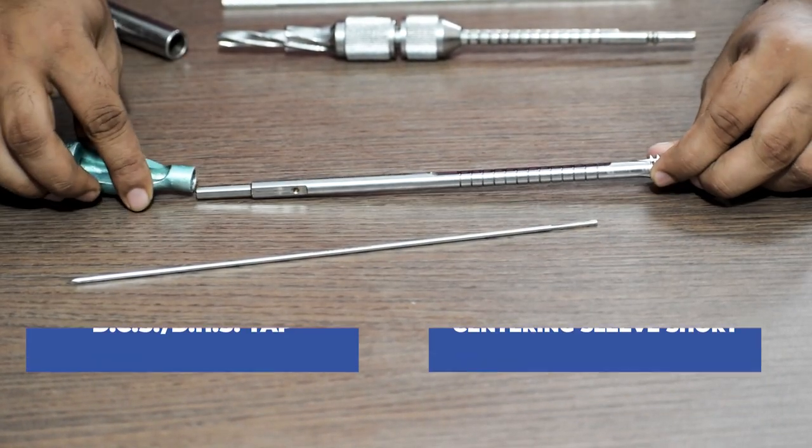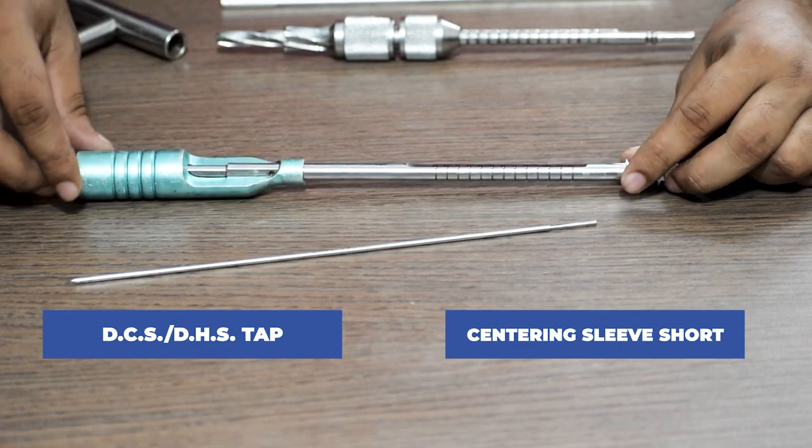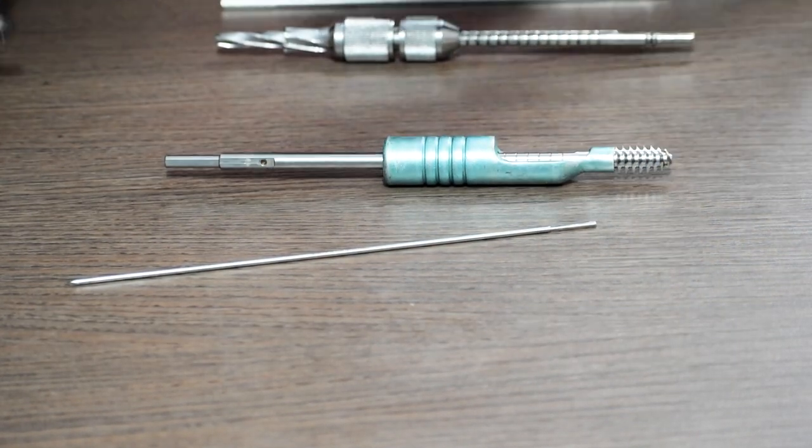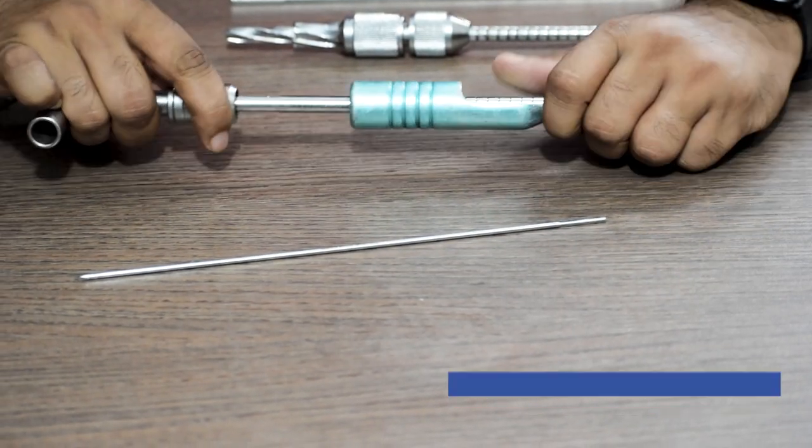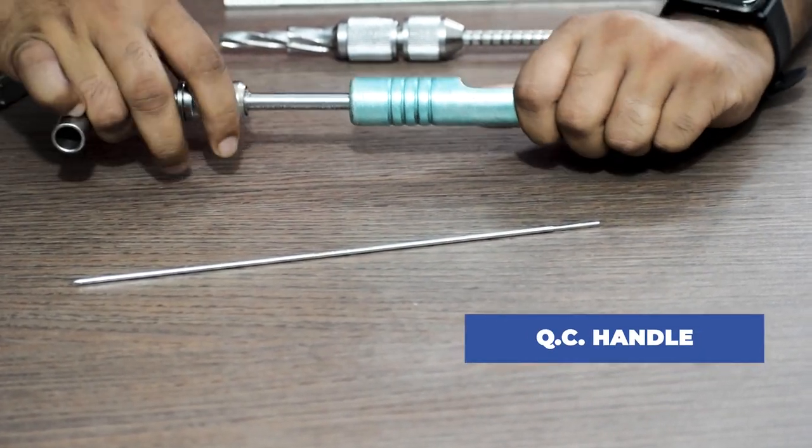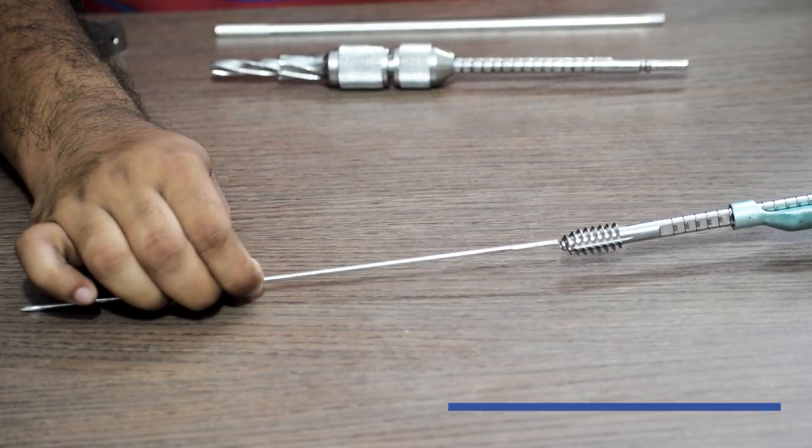Then we use a DCS DHS tap with the short centering sleeve attached to it. Then attach the QC handle at the end of this tap and use it to tap.